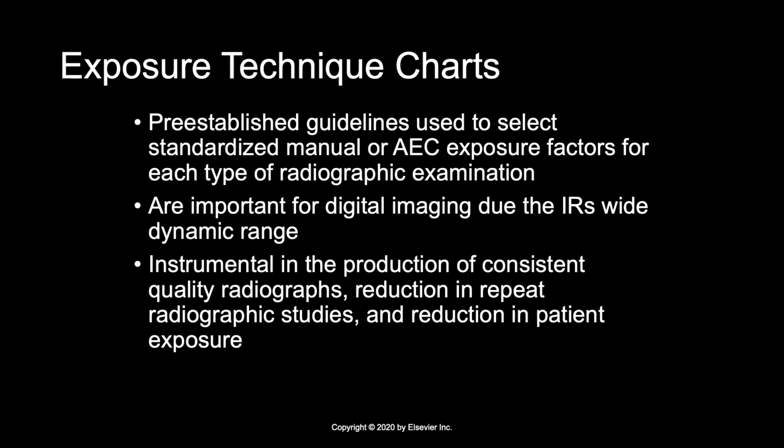And the reason is because they want to keep the quality of radiographic images consistent. So it is our job to take these exposure factors from the technique chart, and of course they're for an average patient, so we want to adjust them for a smaller patient or for a larger patient.